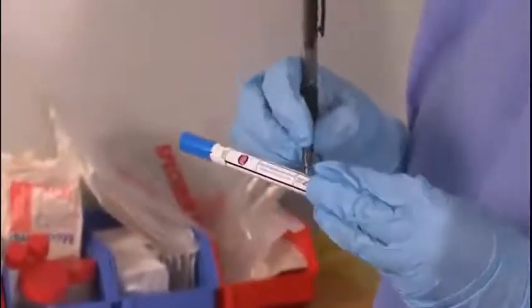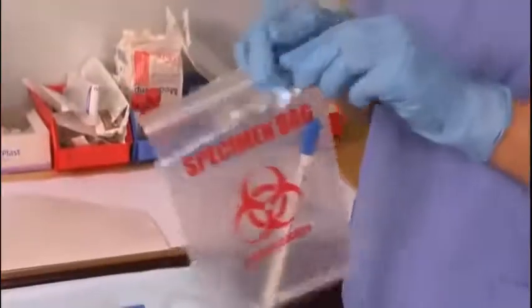Place the swab in the transport medium, label it, and place it in the transport bag.